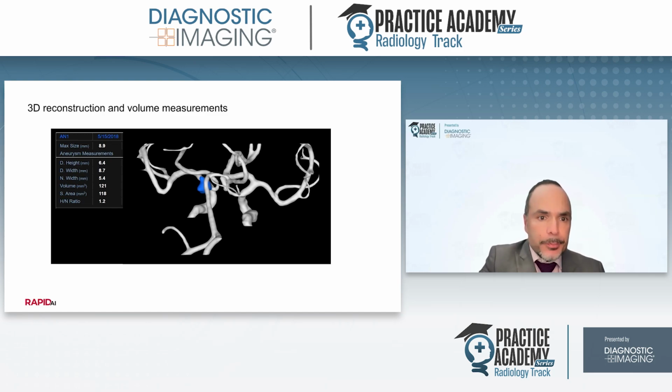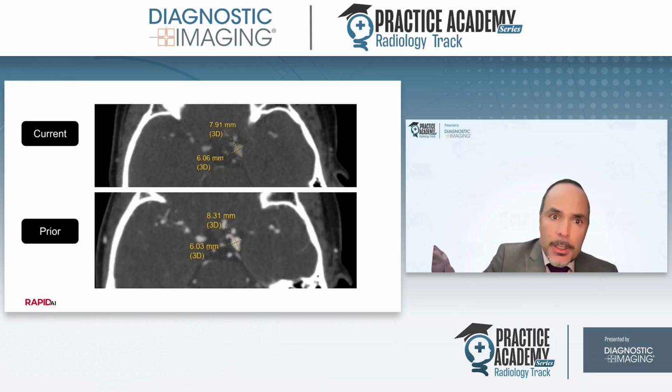But in Rapid, what you'll find from this video is that this process is entirely automated and, again, can allow a very high level of interaction in surgical preview. Now, as I said earlier, this can be scaled up to longitudinal assessments for stability or change. Here are 2 examinations from a patient who had what, at least in the source scan plane, was believed to be a stable or generally stable aneurysm.